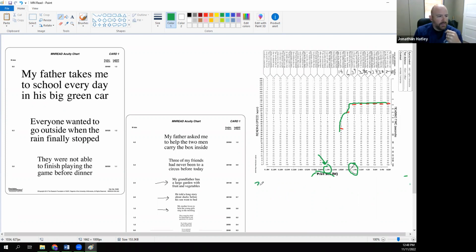And so in this case, our visual acuity fraction would be 0.33 over 2.5 M. So again, to find the right add for this patient, we would need to just flip this over. So we would say 2.5 divided by 0.33. And that should be 2.5 times 3, or about 7.5.